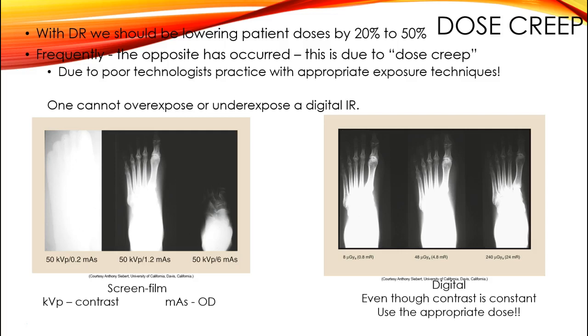They are not thinking it through. They are not paying attention to the techniques that are actually on the control panel, and that is because they're used to these nice images coming out, and they know that the images can be manipulated and acceptable for diagnostic purposes. However, that does nothing for your patient. What is happening is patients are being overexposed dose-wise, even though we don't need to take a repeat due to overexposure or underexposure when we're using digital, because the contrast is pretty much constant and you get a decent image either way.